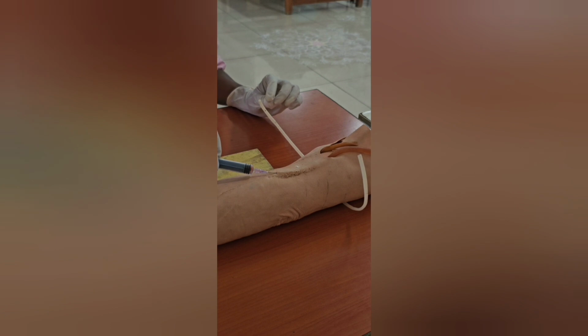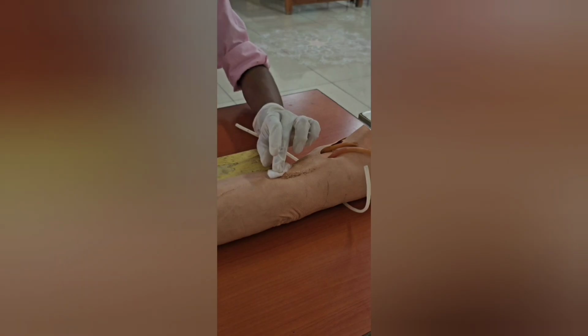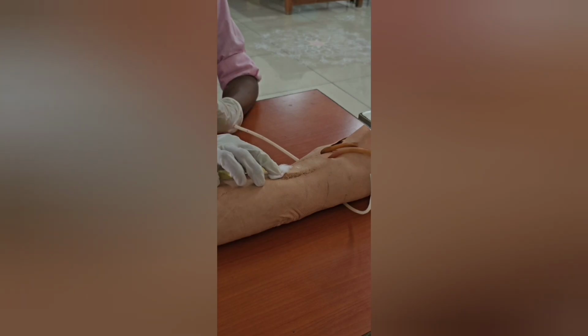Check for pain, swelling and hematoma. Then withdraw the needle swiftly and press sterile cotton onto the opening for a few seconds and fix it with adhesive tape. Once that is done, clean up and dispose the waste safely and reassure the patient once again if necessary and wash your hands.